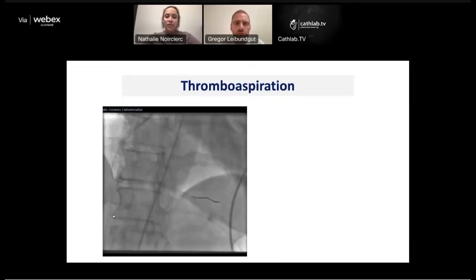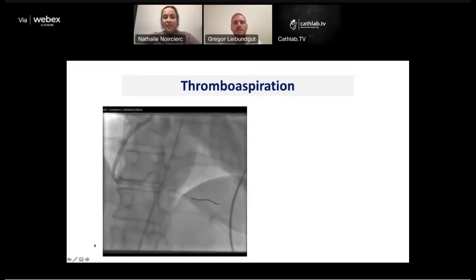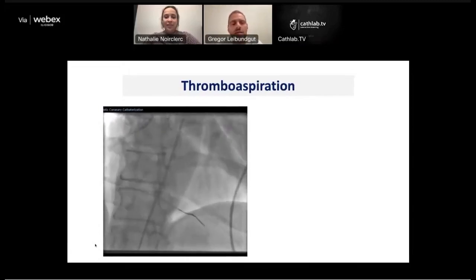We use it for transseptal crossing, septal surfing. But as you see, every wire can have a distal perforation. Of course, with polymeric wire it's more likely because they have less friction. They kind of move themselves sometimes.